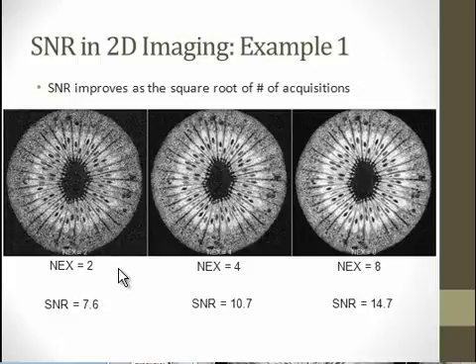Maybe we can talk a little bit about that during the chat this week. What does grayscale mean? Because when you're comparing images, most MRI images are black and white. If you're going to compare these images, you have to make sure that you're looking at them with the same contrast settings, or what are called window or level settings. By placing them into this type of so-called montage, the window and level settings are the same. So now I can compare them.